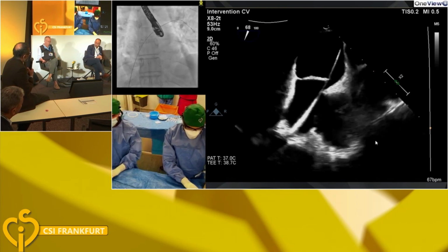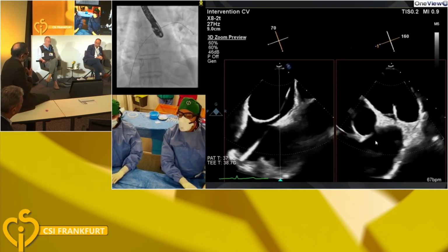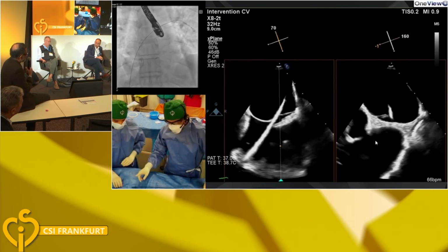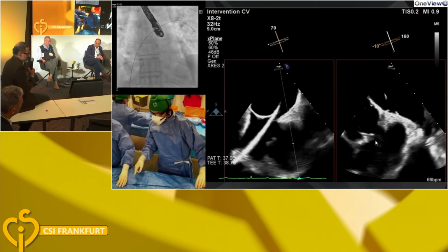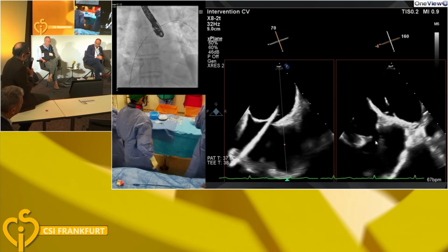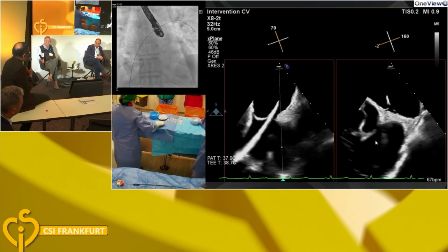It's cured if the shunt is gone. And it does seem, I think it's a me-too device, but it does have a coating. So if you're one of those believers that nickel allergy on the skin has anything to do with anything, you could use this device because it's coated. I personally don't believe it.